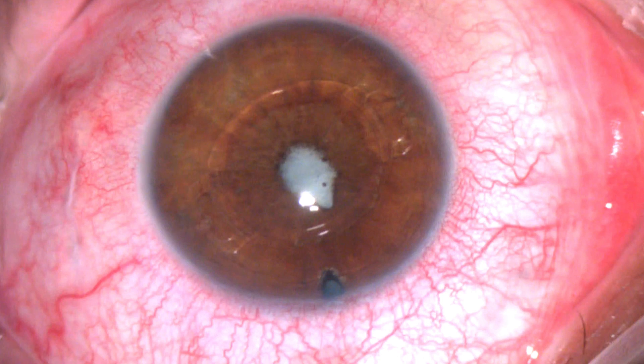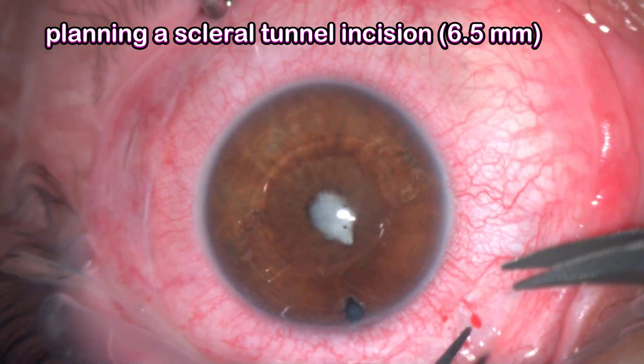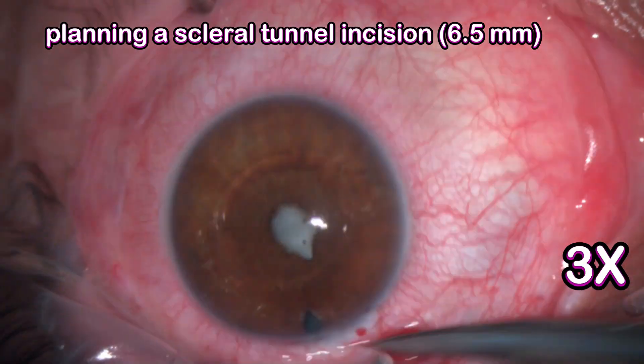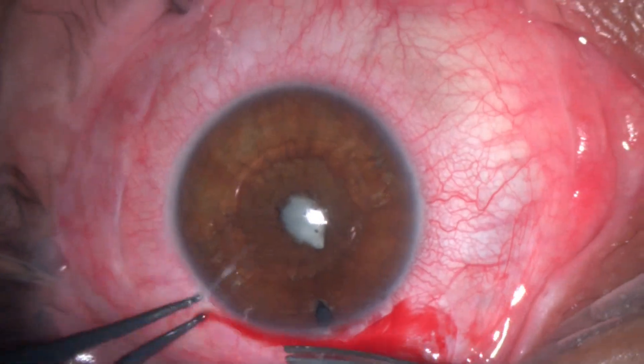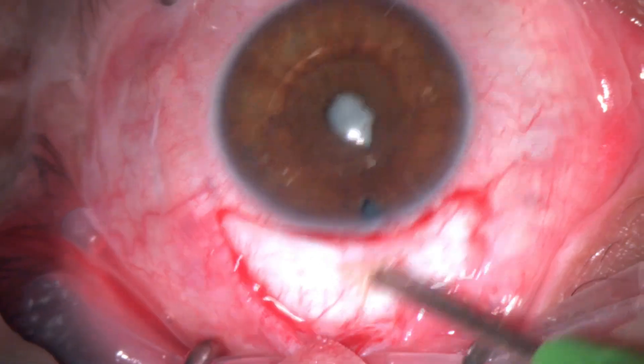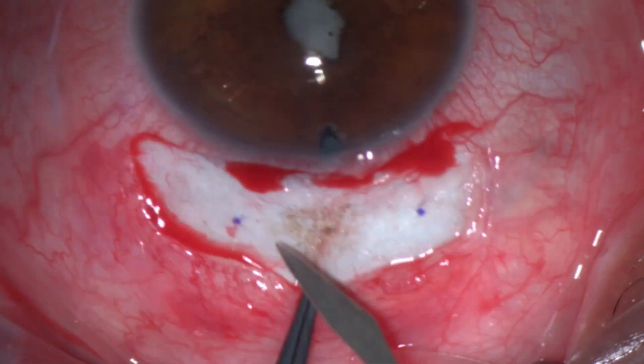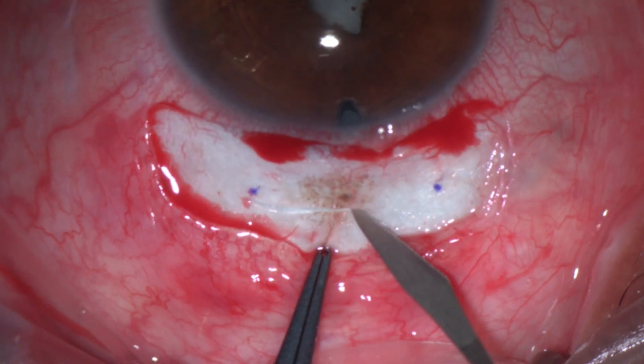I listed him for surgery. I started by planning a scleral tunnel incision — planning two separate incisions. Occasionally in these cases you can use the same scleral tunnel incision for the cataract, but since I'm expecting to do extra maneuvers I prefer to make two separate incisions.